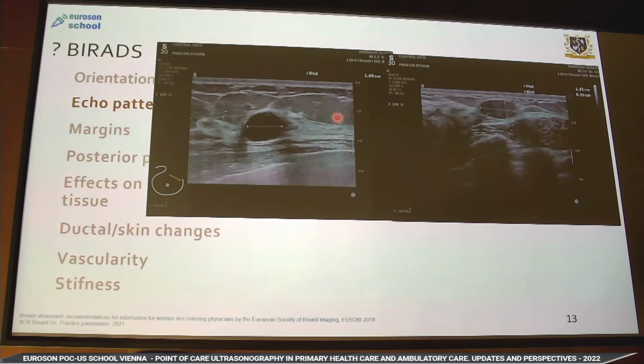If you perform layer type, anatomical type of ultrasound, it is very easy to know. Skin, superficial fascia, preglandular fatty tissue, glandular tissue, lesion in the breast, not in the fatty tissue. I have the direct comparison, and this is valid for always when you perform it.